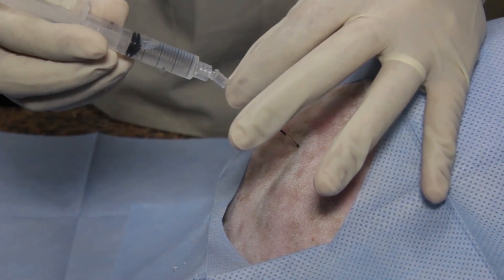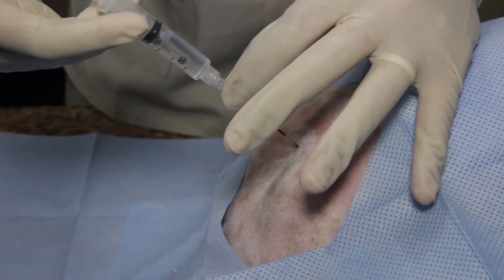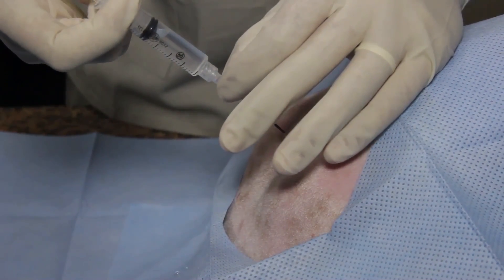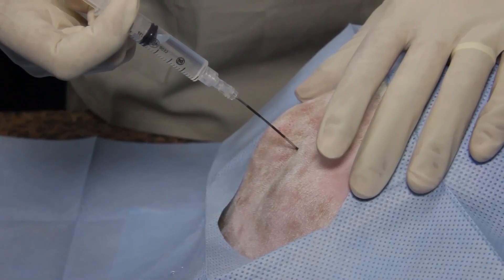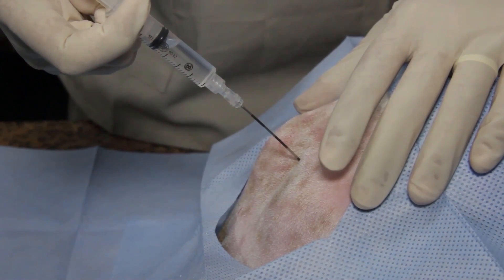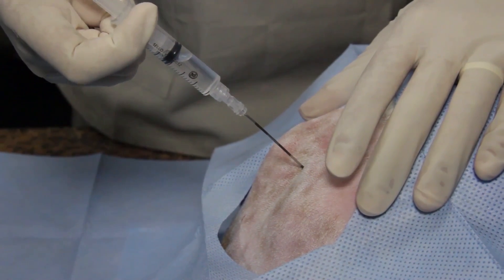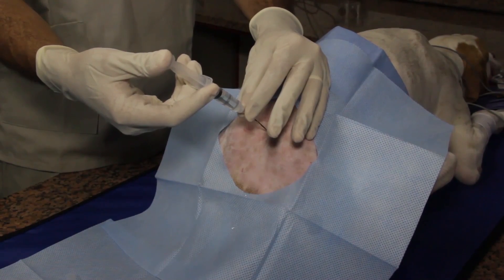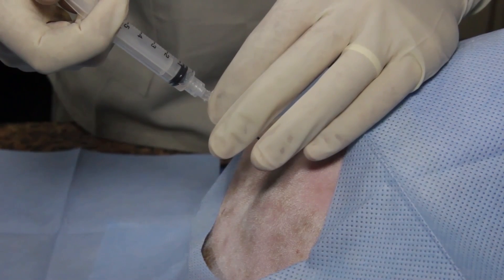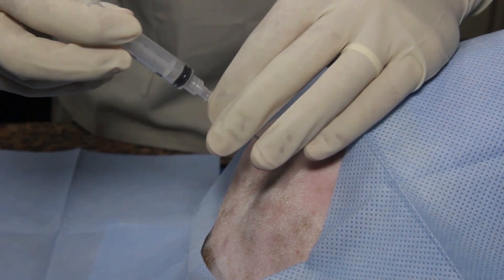The syringe with preservative-free medication is connected to the needle. The small air bubble in the syringe is used to assess loss of resistance during the injection. This air bubble should not be compressed during the administration of the injectate. The volume injected is 0.2 millilitres per kilo up to 6 millilitres. A slow injection is important to achieve a homogenous distribution of drug within the epidural space.